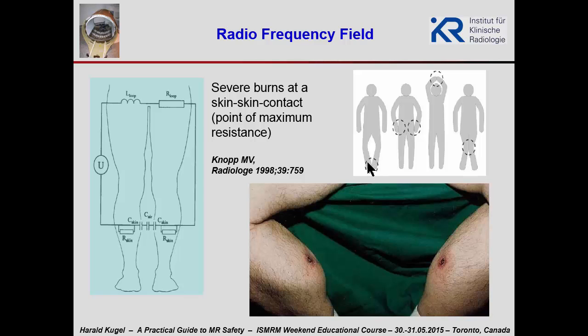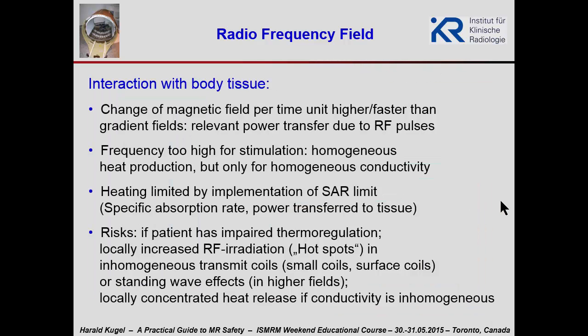The risky situations are when the patient is not properly dressed: feet-feet contacts, or contacts here, knee-knee or thigh-thigh contacts, hand contacts. One has to avoid this.